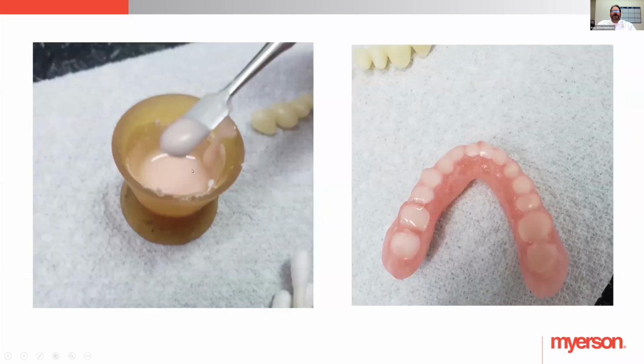And then take your acrylic. I recommend that you filter the fibers out if you have fibers, or order an acrylic that is fiberless. They'll kind of show as little specks at the necks of the teeth. Also, the fibers could possibly cause a gap or a spacer in there, if you will, and cause problems.